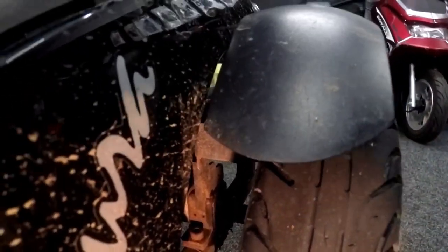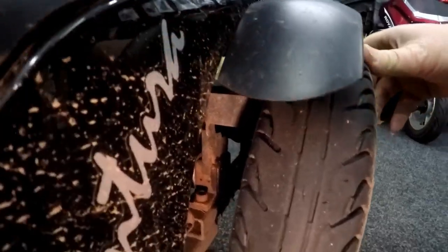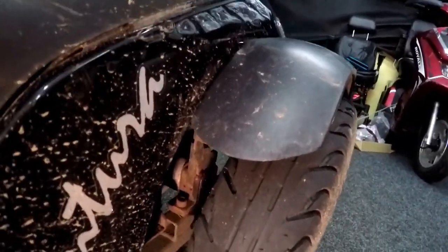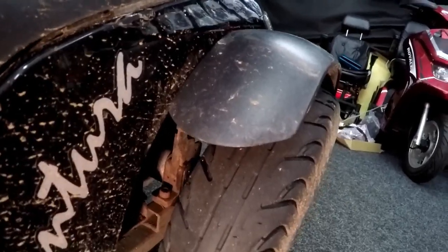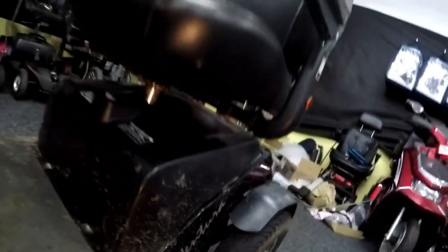We have them, we can get them. If you need a transaxle, give us a shout. We can supply you with one. So sadly to say, that's gone, and of course you'll be lucky if the customer's had this for 6 months and the dealer sold it, so technically speaking it's not fit for purpose, but trying to get hold of this guy is a contract and a half.